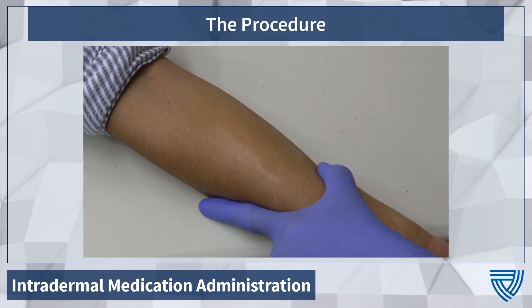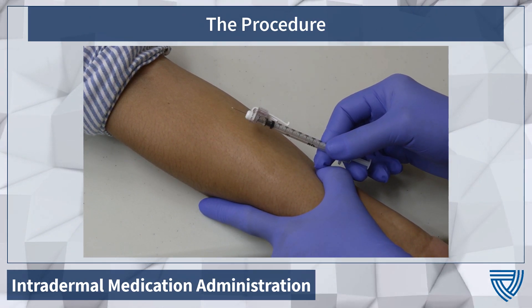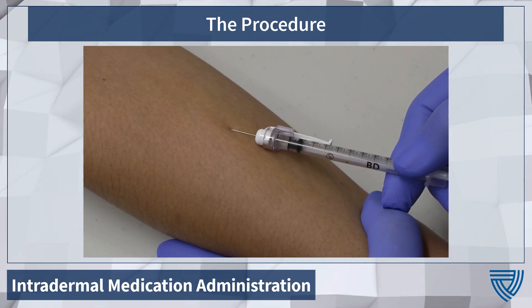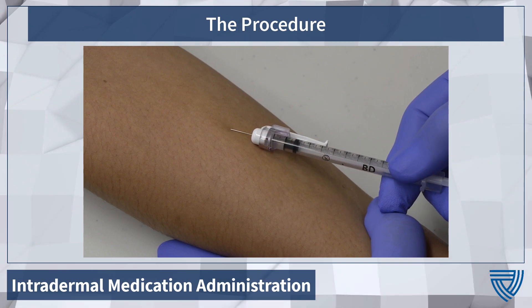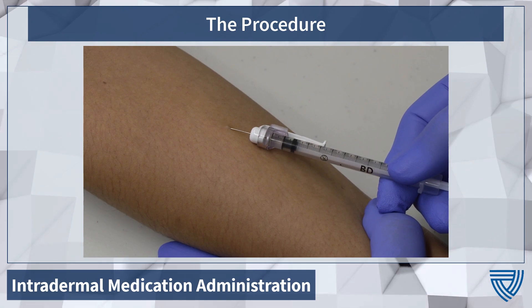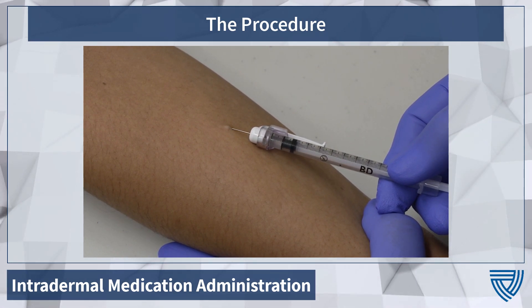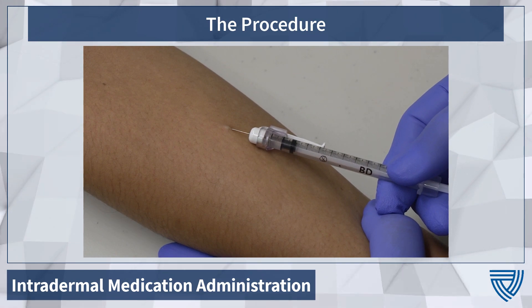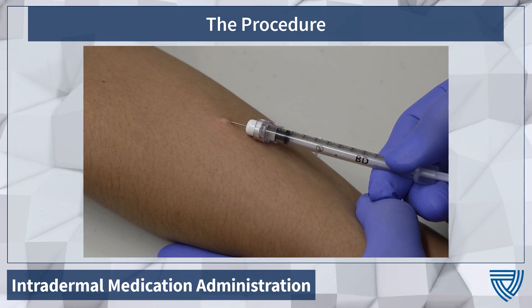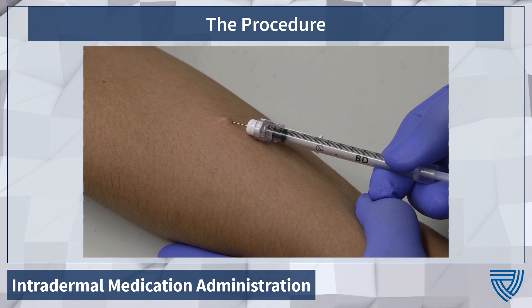While holding the skin taut, we will use a 5 to 15 degree angle with the bevel of the needle up, and you will be inserting the needle bevel until it is just within the skin. Slowly insert the medication until you see a wheal, bleb, or blister-like formation and have injected the entire 0.1 milliliter dose.